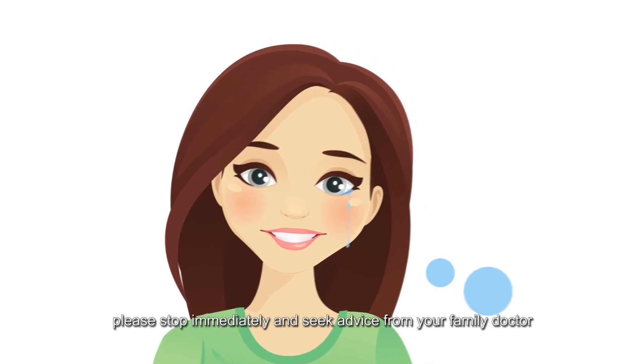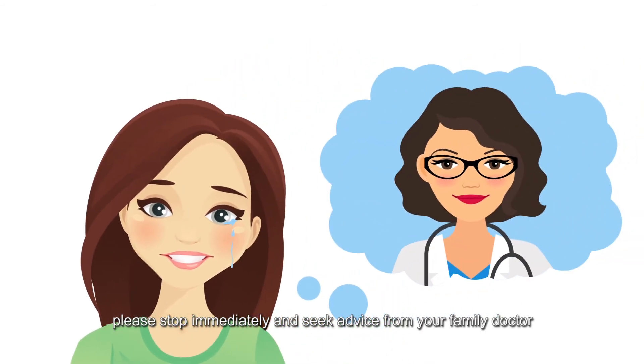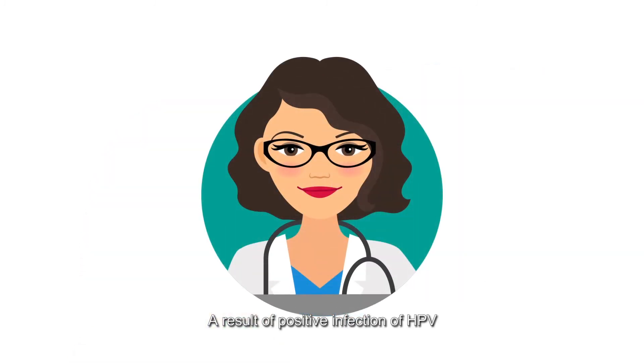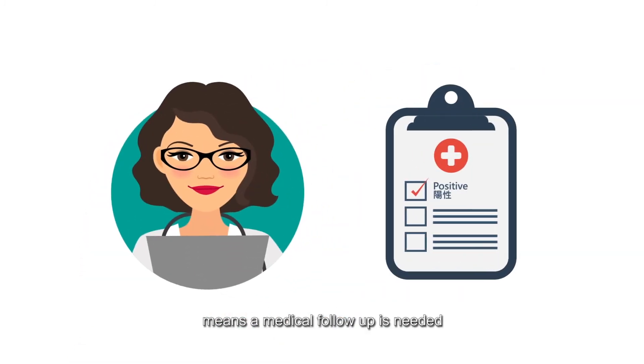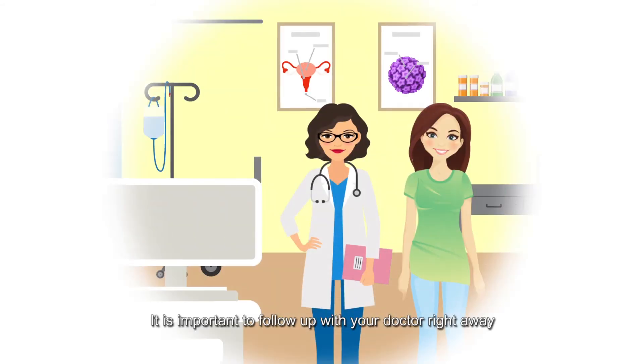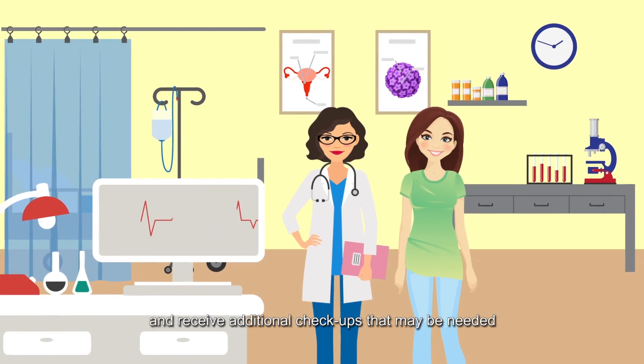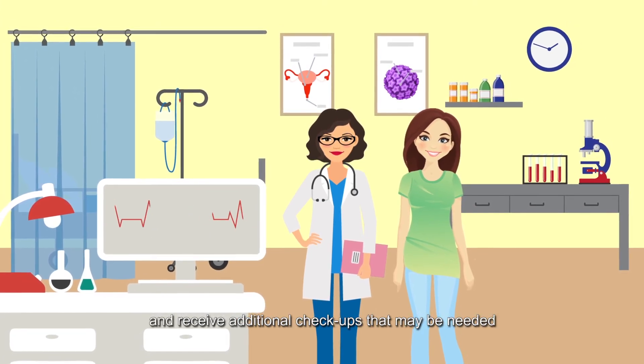If you have pain, please stop immediately and seek advice from your family doctor. A result of positive infection of HPV means a medical follow-up is needed. It is important to follow up with your doctor right away to learn more about your test results and receive additional check-ups that may be needed.